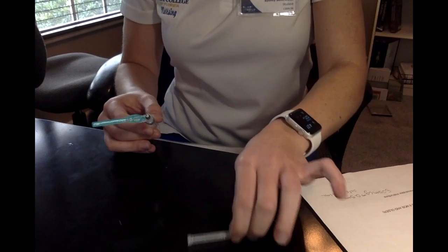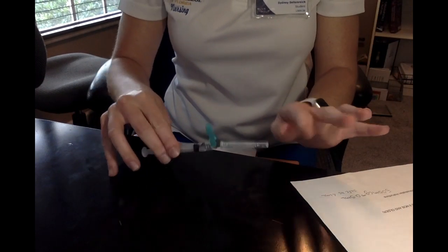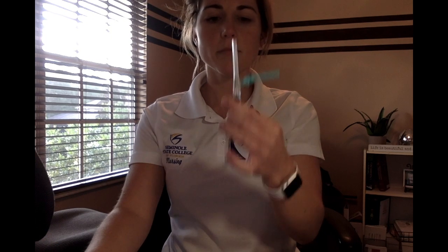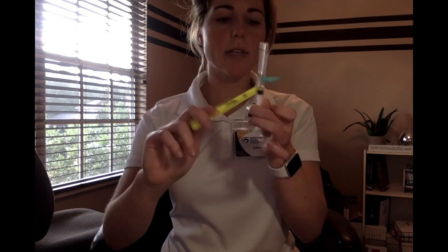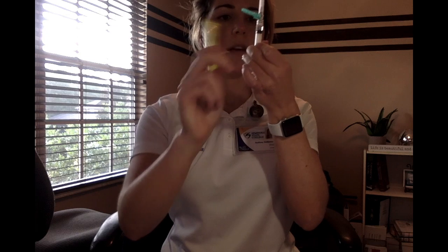And then to recap, we would do it like this. Okay. So multi-dose, we would label it time, date, and initial. And then for the syringe, we're going to go ahead and tap if there's any air bubbles. Okay, looks pretty good. And then we would label the syringe with the patient's name, the drug dose, time, date, and then my initials on here.